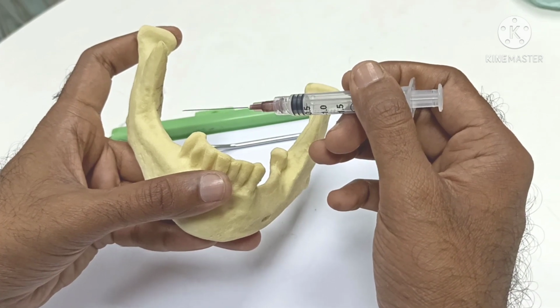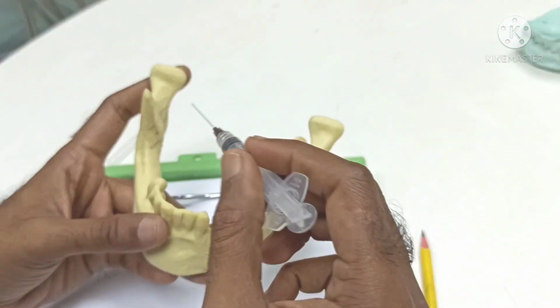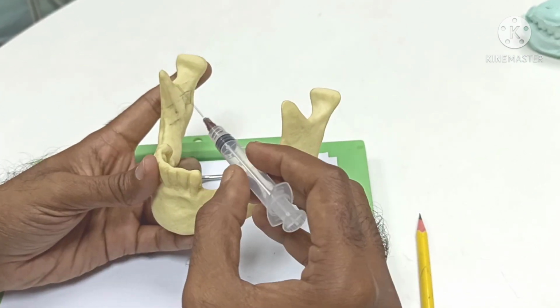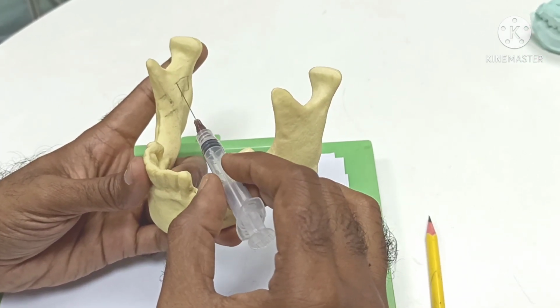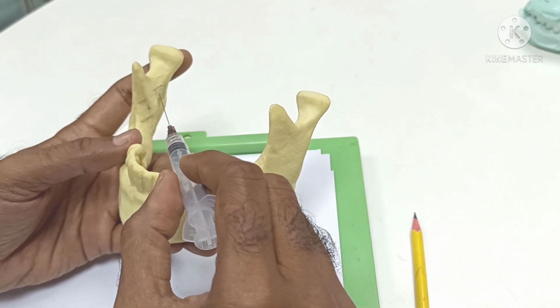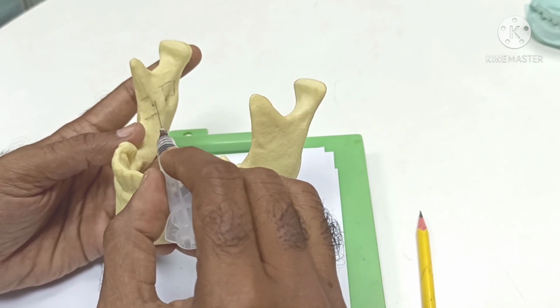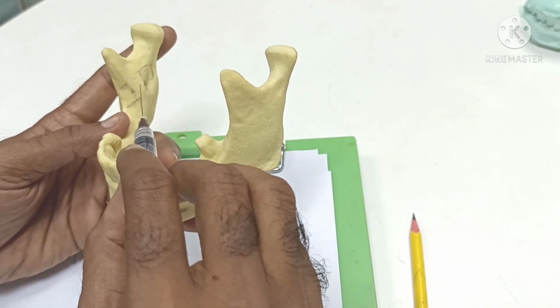If it is angled like this, then you may deposit the solution below the foramen and we may have failure. So the first thing is from the opposite premolar, and the second thing is about 6 to 10 mm above the occlusion plane. The third point is just anterior to the pterygomandibular raphe, there you can inject.